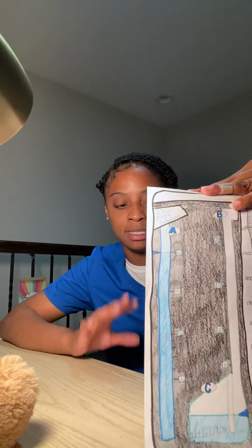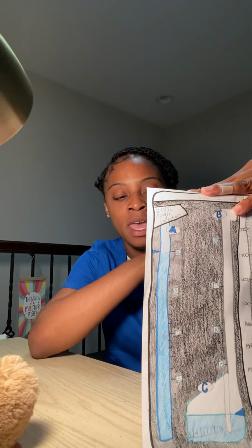Anyway, in the case that there was some bubbling, there may possibly have been a leak somewhere in my patient's tubing. I would clamp it starting at the dressing site to see if there's a leak closer to the patient, and I would go every few inches all the way to the top of the tubing at the drainage system.